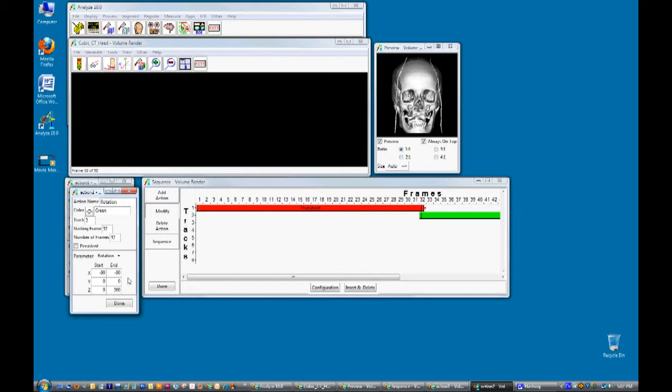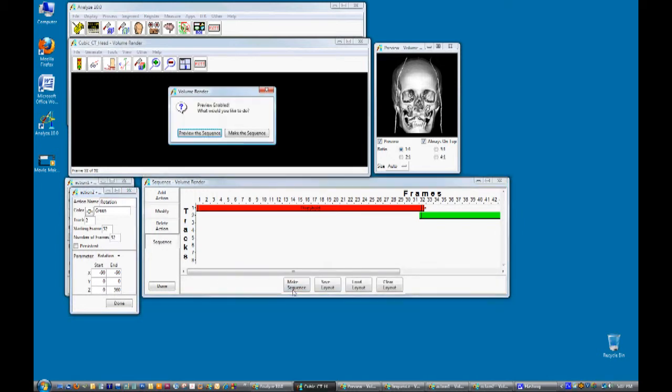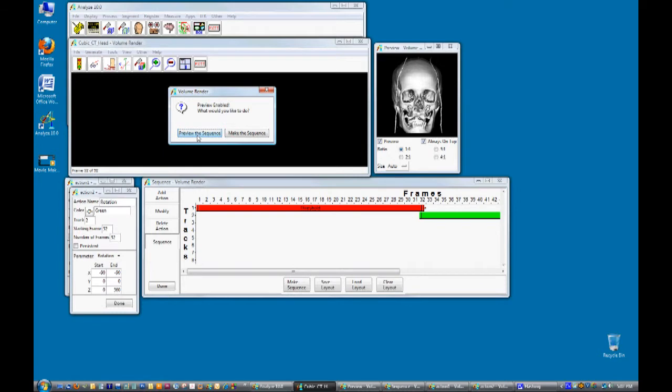To review the movie select sequence, make sequence, and then click on the preview sequence.